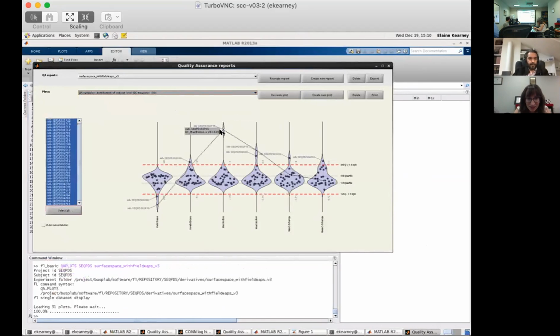Okay, so is it this guy? Yeah. And that's max motion, not mean motion, so maybe that's not problematic then. Right, and the mean motion, I don't quite see. The fourth column is the mean motion. Could you hover the mouse over the highest point in there just to see the value? What number does it say? 1.27? Okay, so that's relatively high. Okay, so that's a bit high.